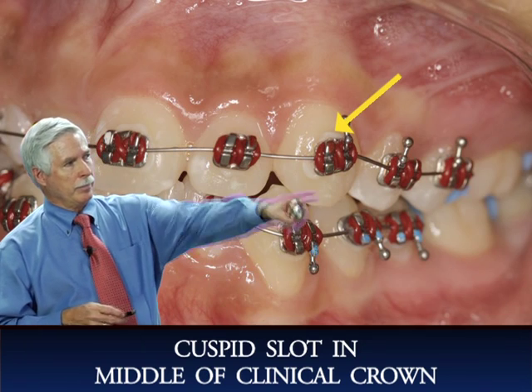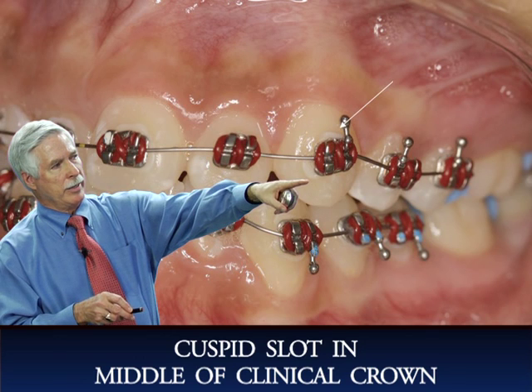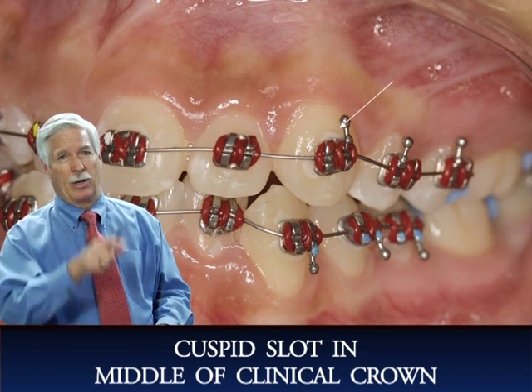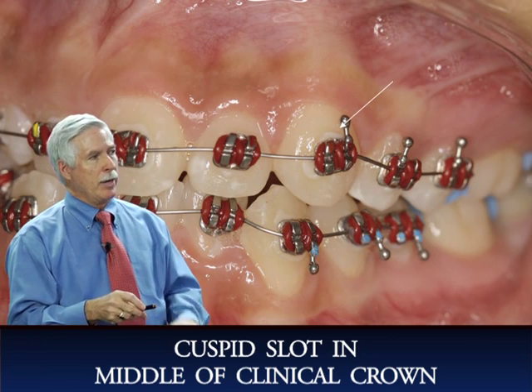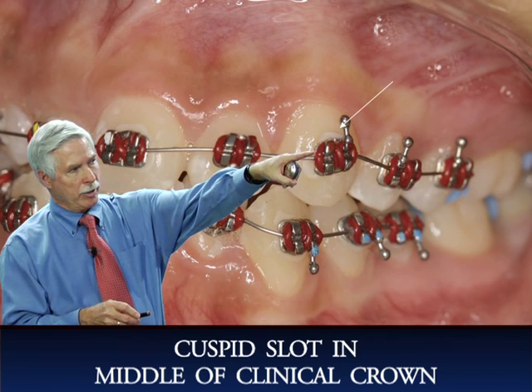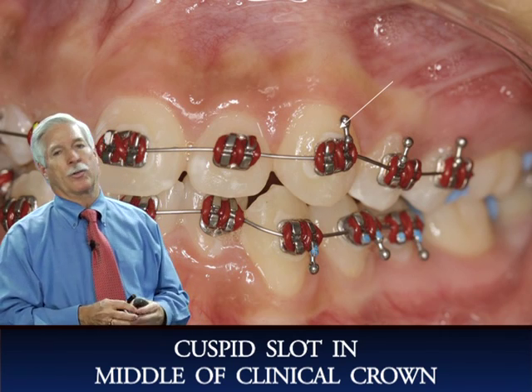The cuspid is supposed to be placed in the middle of the clinical crown. So again, you measure from the gingival margin to the tip of the cuspid, and say that's 10 millimeters or 11 millimeters long, say it's 11 millimeters, then 5.5 would be the midpoint. And so you put the slot 5.5 millimeters from the cuspid tip to the bracket slot. So that bracket, I think, is correct. The bicuspids are also correct.